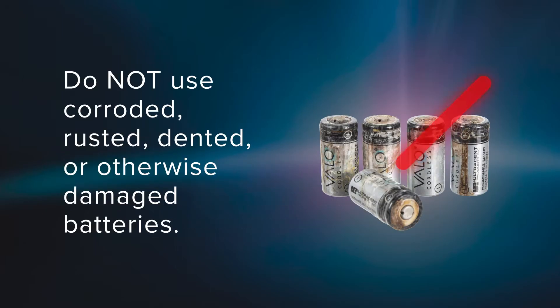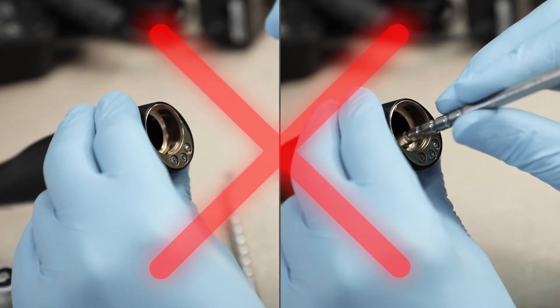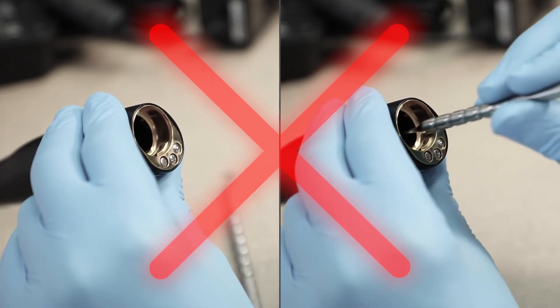To avoid the risk of injury, do not use batteries that are corroded, rusted, dented, emit an odor or fluids, have a torn or missing wrapping, or are otherwise damaged. To avoid damaging the equipment, do not insert fingers, instruments, or other objects into the battery compartment of the curing light.